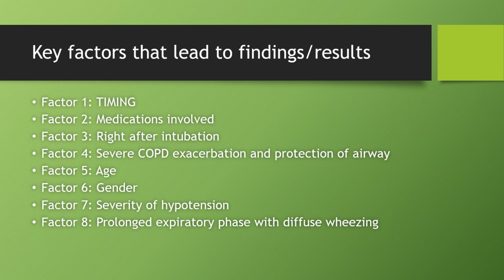So there are factors that lead to the findings. The first factor is the timing. It was very rapid, right? We were told that she underwent rapid sequence intubation, and shortly after intubation, she becomes hypotensive. So timing is very important here. I would imagine it is between 15 to 30 minutes for these medications to act. It's very rapid. The second factor is the medications involved.